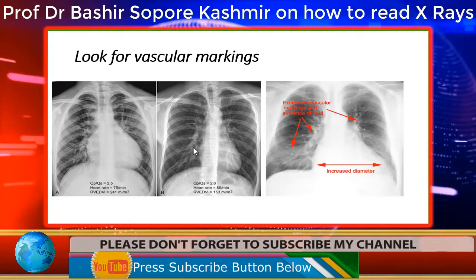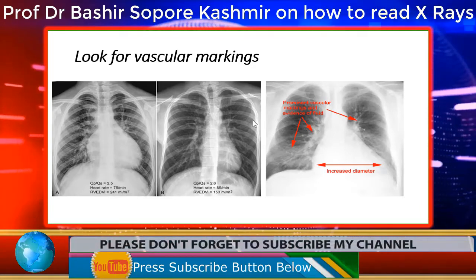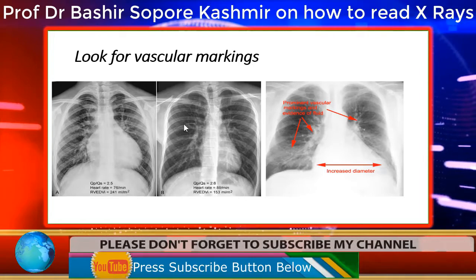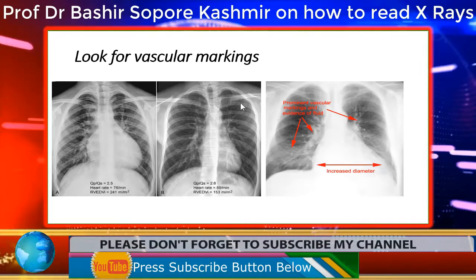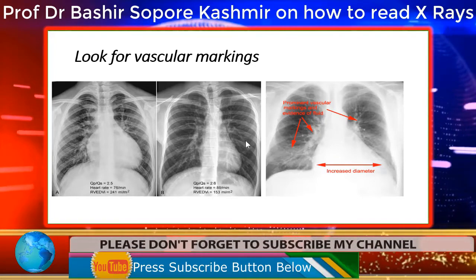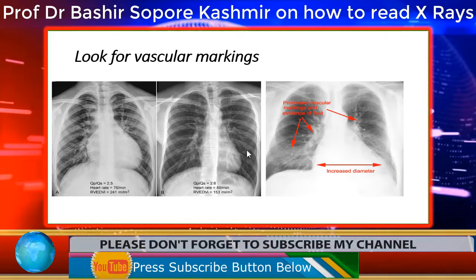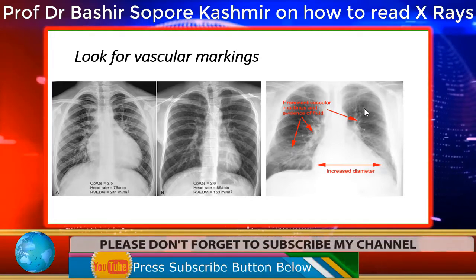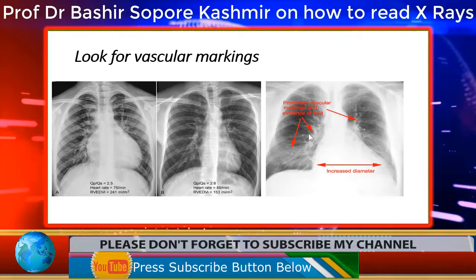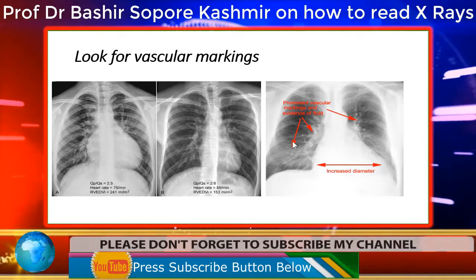In this you can see that the vascular markings are more prominent towards the center than towards the periphery, but we do see these small, narrow linear opacities, which we call vascular markings. You can see this line going up, then this line is going up, this line. Here the vascular markings are more prominent. You can see they are a little thicker, right?